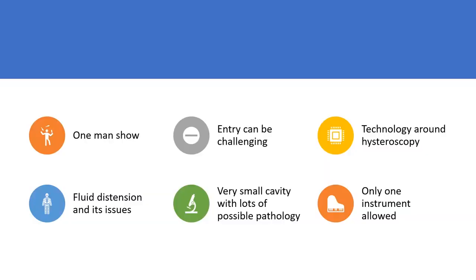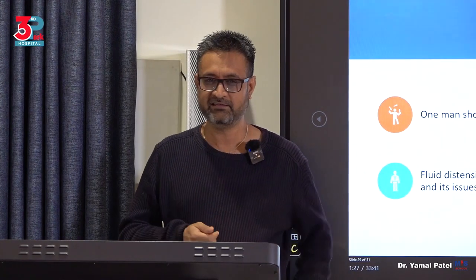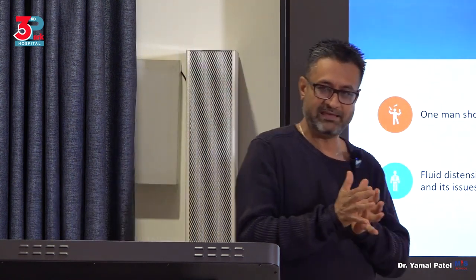So if you're not careful, you can easily complicate matters there. You need to understand fluid distending media and its issues around it. It is a very small cavity. The uterine cavity is actually a very small cavity with lots of pathology. So you can imagine you have a very limited space to play around with in hysteroscopy.